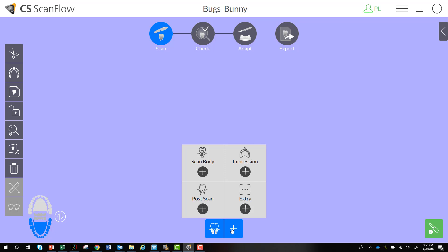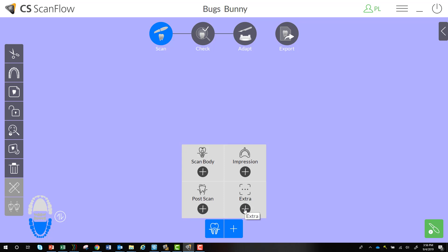Selecting the plus symbol opens up options for taking additional scans — you can add your scan body, pre and post, or impression for the hybrid workflow. Under Extras, you can scan any additional model, appliance, or anything else you want to incorporate into the case, so when it goes to the lab, you can easily send all data sets together within one send through CS Connect.